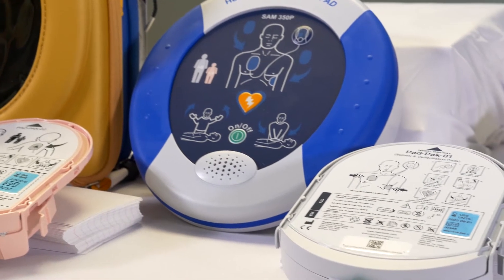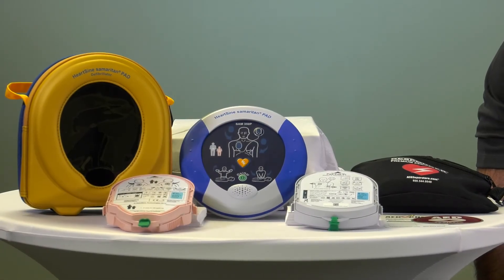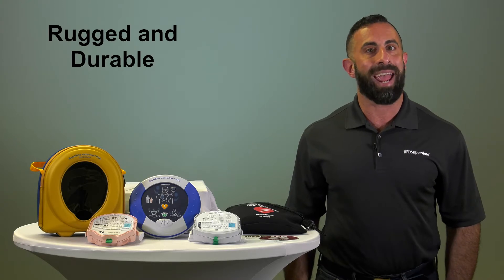Even though the AED is compact, it has the highest level of protection against dust and water with an IP rating of 56, which makes it rugged and durable.